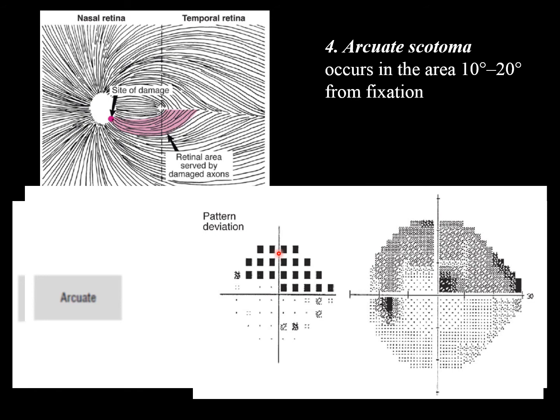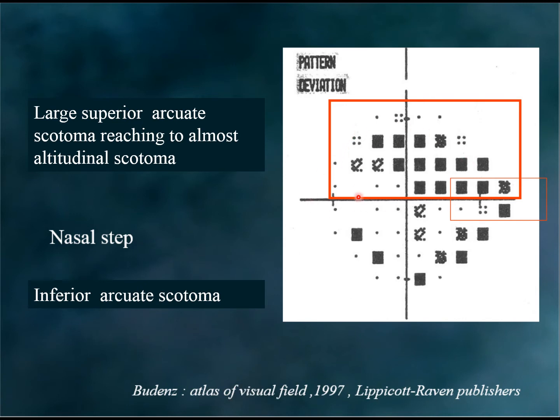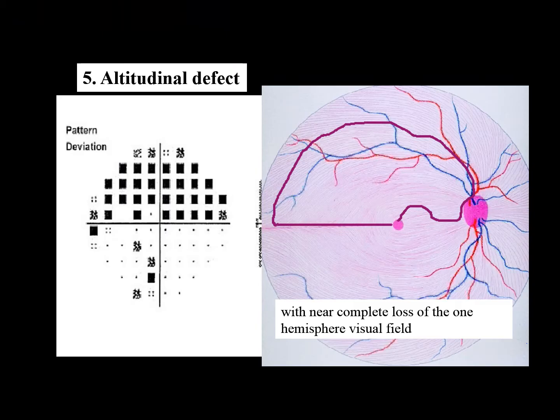The arcuate scotoma can encroach more and more on the rest of the field, reaching almost to an altitudinal defect but not yet complete. Here we have an arcuate scotoma reaching up to altitudinal, plus a nasal step due to asymmetric changes between hemispheres, and an inferior incomplete arcuate. Isolated one or two non-contiguous points are not accepted as true change; points must touch one another to represent a significant area of defect.